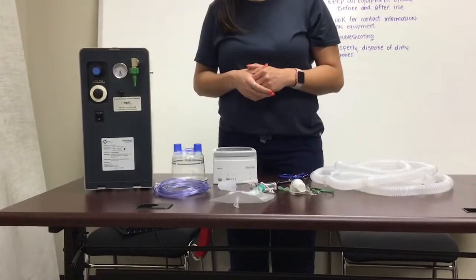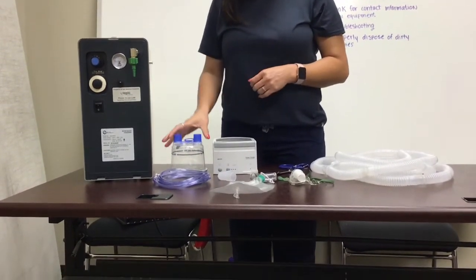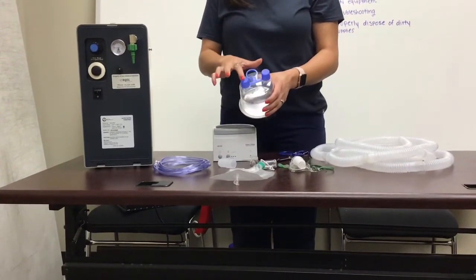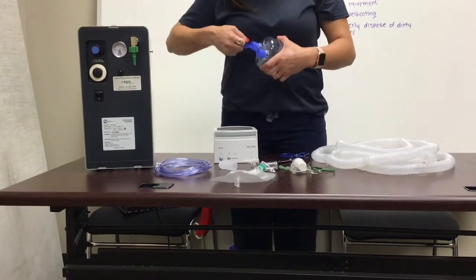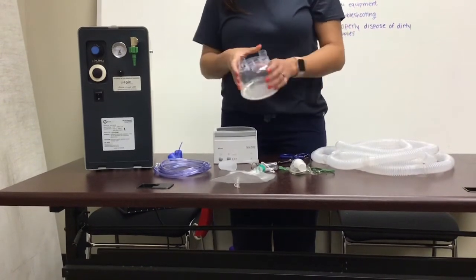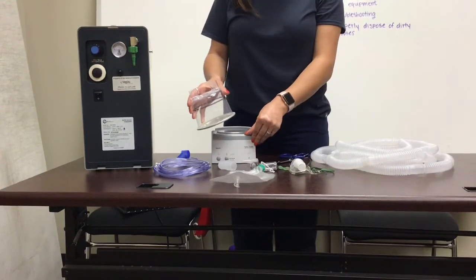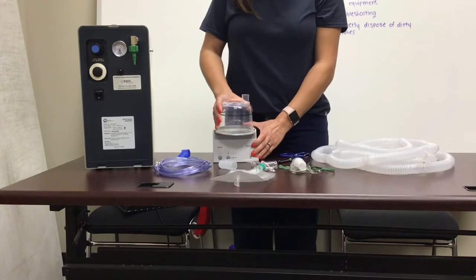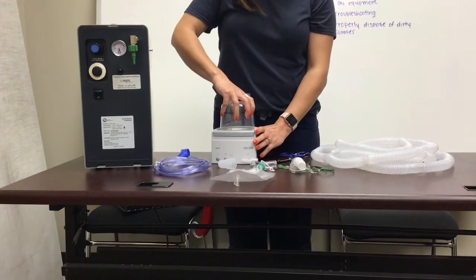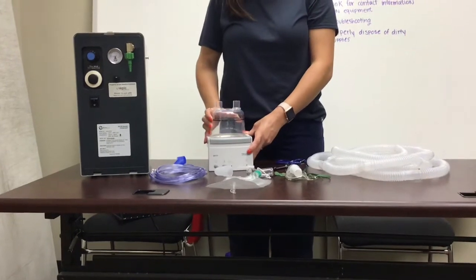This next clip will show you how to set up your 50 psi trach collar heated. First, you will be given your water chamber that is provided to you. You will receive this with blue caps on the top. You want to make sure to pull these off and take these caps off. You will then slide your chamber onto your heater. You want to make sure to pull down on this clamp and align, making sure that both sides are in. Once it is in, you will hear a click, knowing that your water chamber is in correctly.